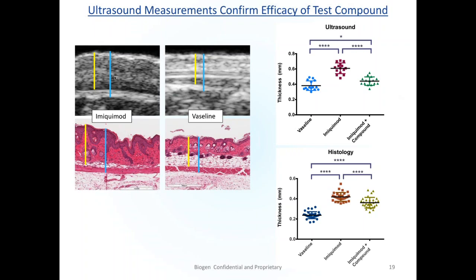Because in the end of the day, having a clear, measurable signal on ultrasound is fine, since we've already identified that there's something we can follow, and it's going to change whether or not we treat with a given compound. That alone would be fine, but we really wanted to understand as much as we could about the mechanism and biology of what was going on. So we really had to go side by side and do some comparisons to the histology so that we could have at least a theory of an explanation to talk about what these signals mean.